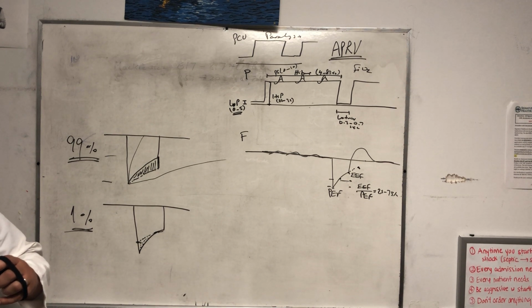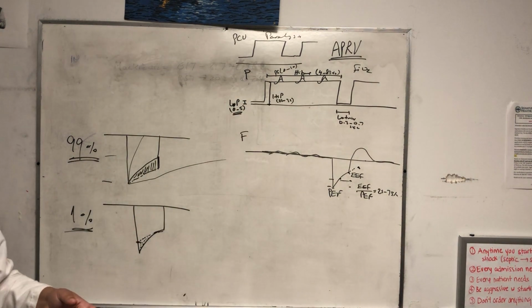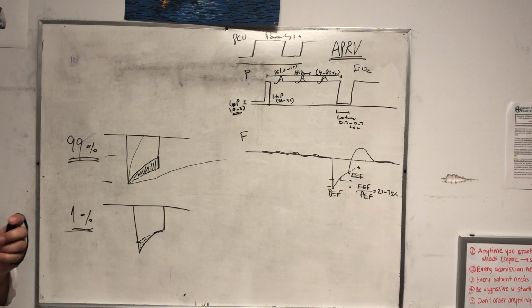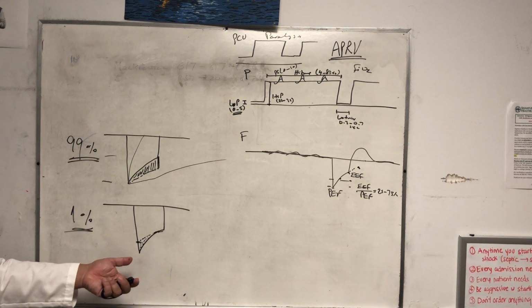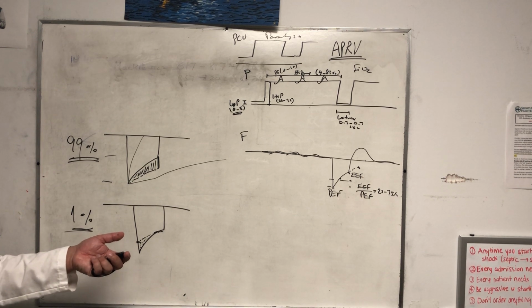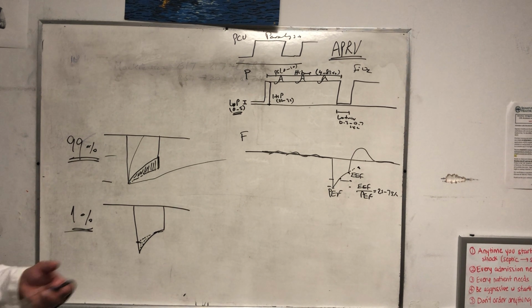8 of PEEP, right? 10 of PEEP. This is like 35 of PEEP. This is a huge amount of PEEP. No bronchus will dare. Even if the nerves, everything is telling the bronchial cells to constrict, I can't constrict. There's 35 of PEEP there. So that's why you never see it, and that's another claim to fame for this mode. But you can see it if you have kinking of the big upper airway, kinking of the endotracheal tube, mucus plugs, something like that can happen like this, right?